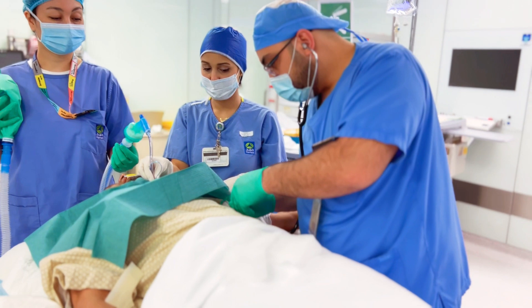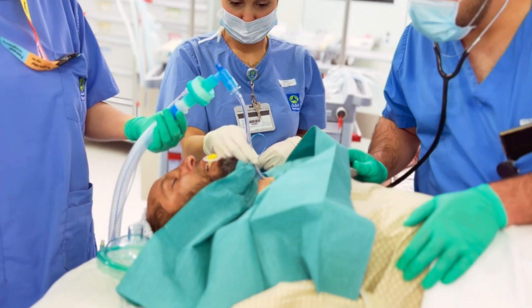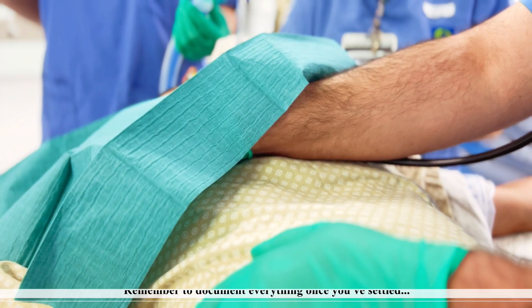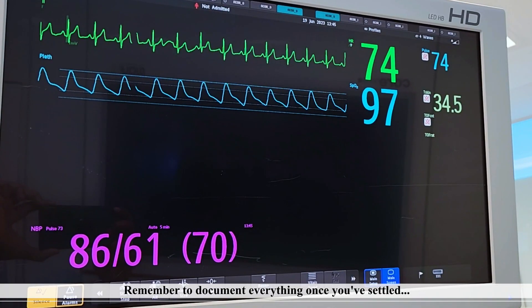Proper positioning of the tube is confirmed by auscultating breath sounds, observing chest rise, and assessing end-tidal carbon dioxide levels.